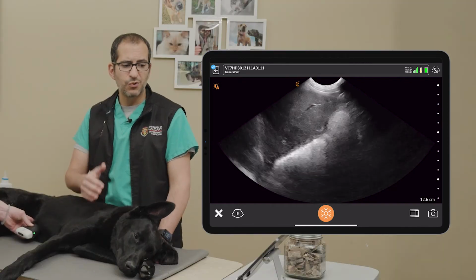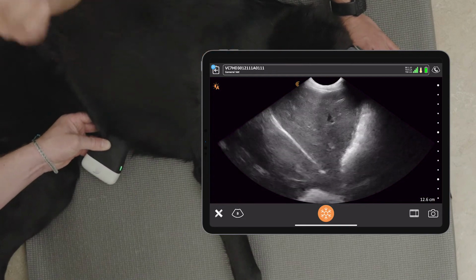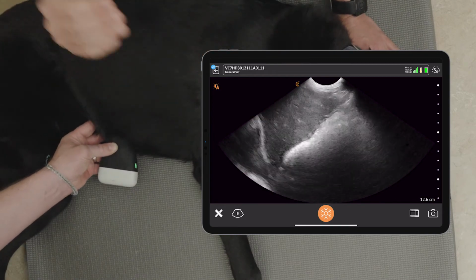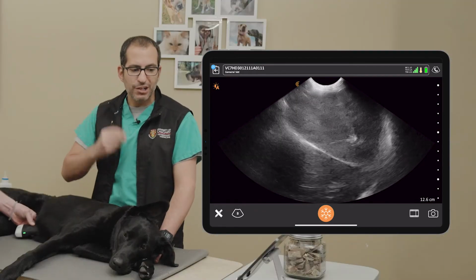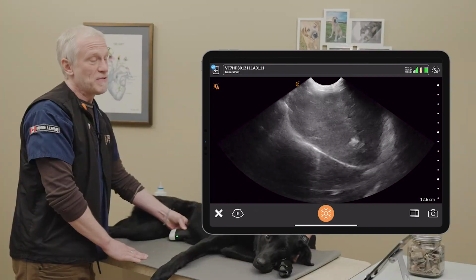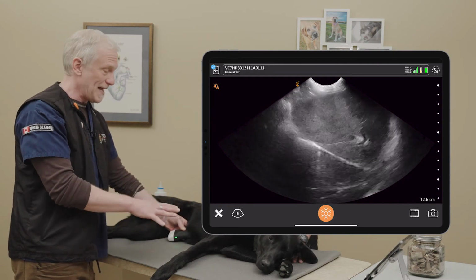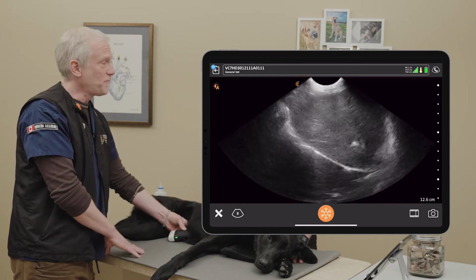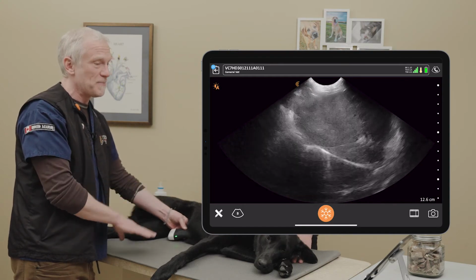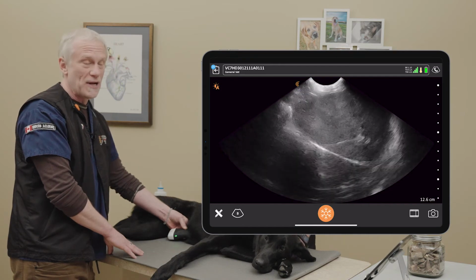100%, Dr. Boysen. So if we see you breakdancing in that stomach, we rule out generalized ileus. Now, one thing, Dr. Boysen, since we're at the heart, something a little new, we can look for contraction during CPR. Absolutely. So this is another site when you're doing active CPR. If our patient was most comfortable in lateral, and that's the position that we are doing our CPR, I can actually put the probe on at the subxiphoid. I can see the heart here at this subxiphoid as you see now, and we can actually judge the degree of compression during active CPR.